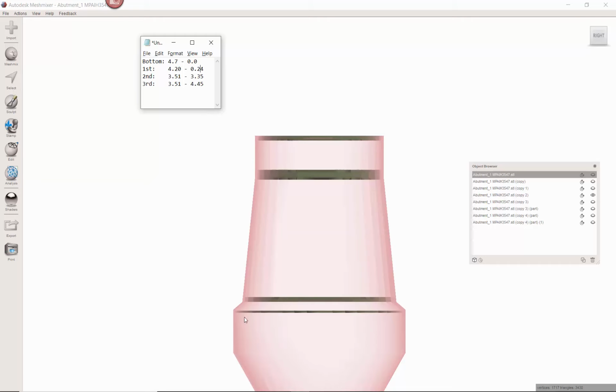Okay, so again, we've got a starting point, 0, 4.7. The next height, 2.24 millimeters, is 4.2 millimeters diameter. And then this point right here, it is 3.35 millimeters up with a diameter of 3.51, and the very top, it is 4.45 millimeters tall with a diameter of 3.51.